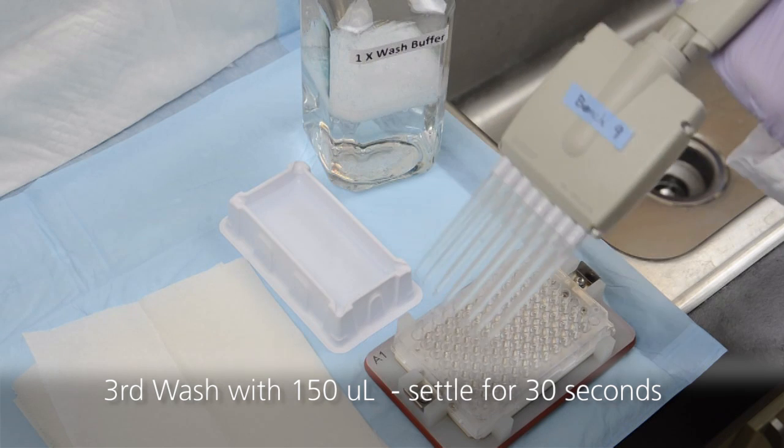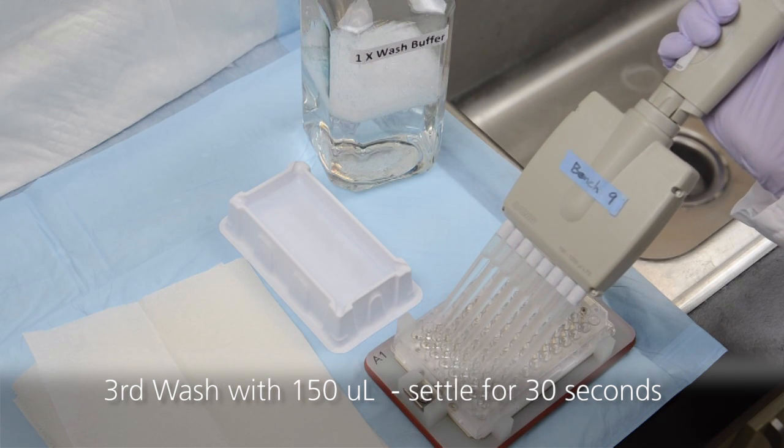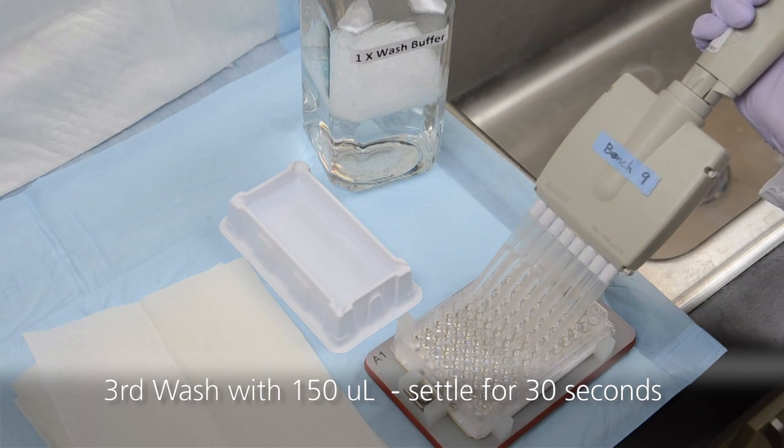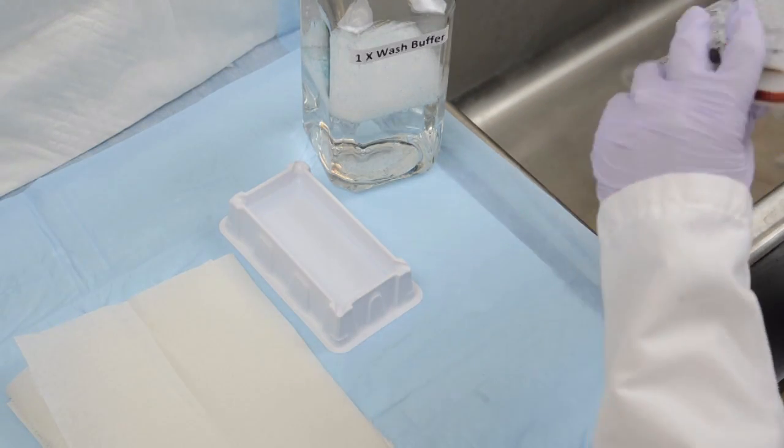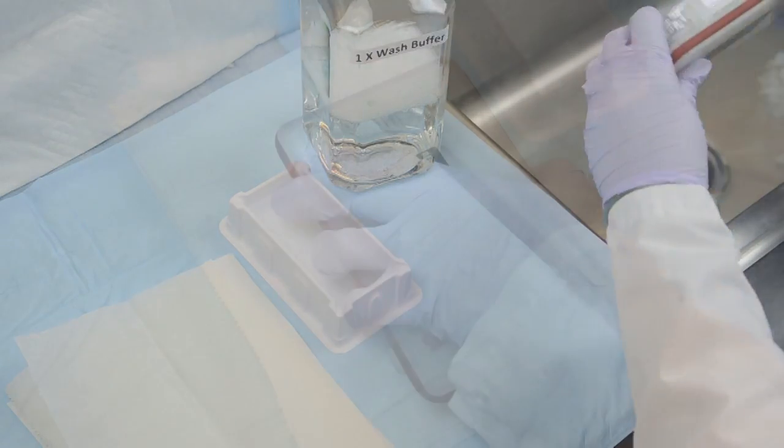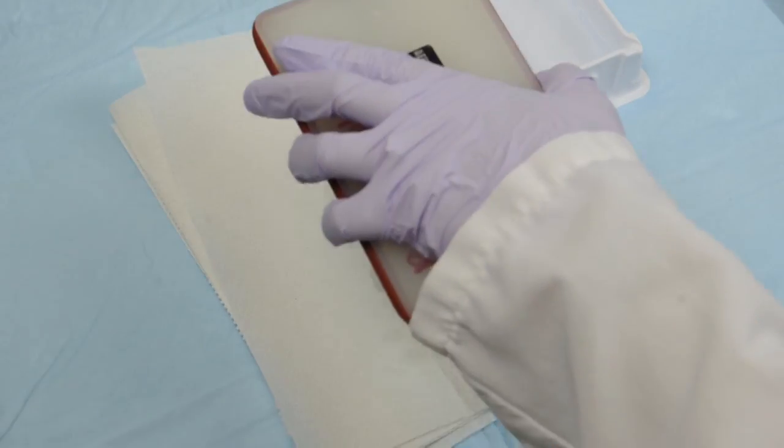Wash the plate for a third and final time by pipetting 150 microliters of wash buffer into each well. Allow the beads to settle to the bottom of the plate for 30 seconds and then invert the assembly over the sink and blot on paper towels.